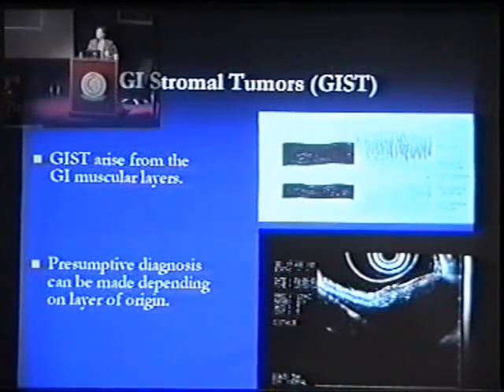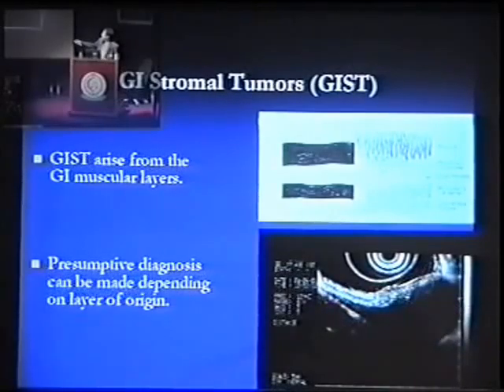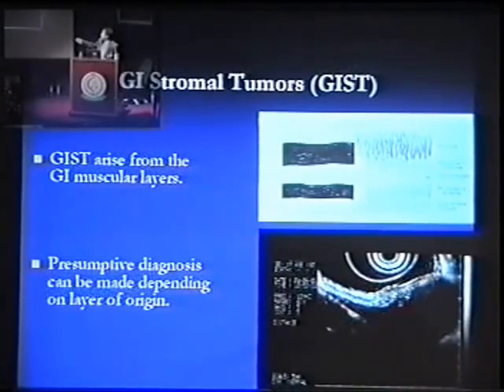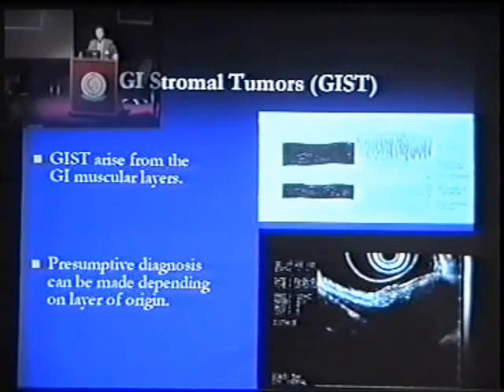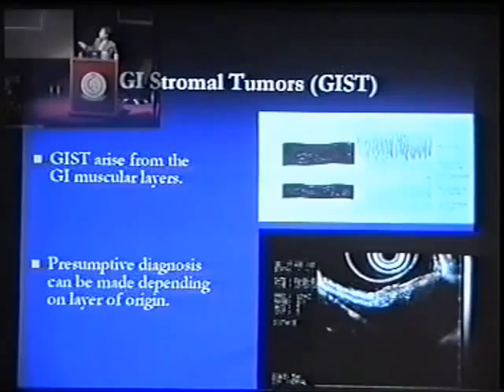Looking at the layer in this case, there's a big lesion, and this is continuous with the second black layer. So this is originating from the muscularis propria layer. By that, we can be confident that this is a GIST.